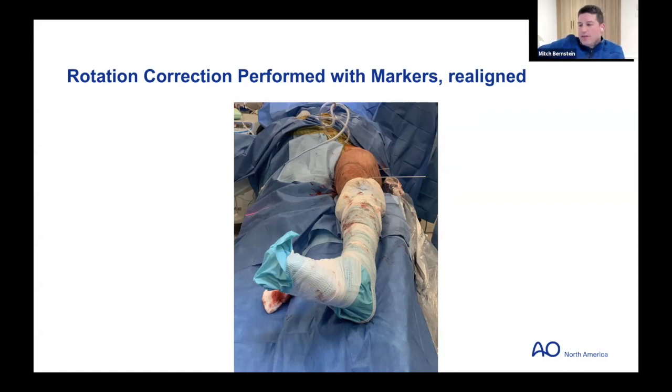Matt talked about one of his learning objectives was preparing for the case, which we always talk about. But what's your rhythm in the OR for these? Do you have physician assistants or minions that set up the patient, or are you setting up the patient? Because if you come in and the leg is draped, you're not necessarily doing a lesser troch profile of the other side. What's your rhythm before?